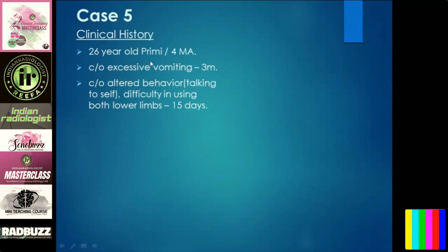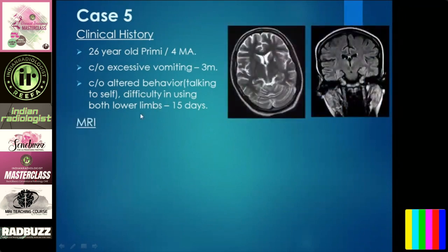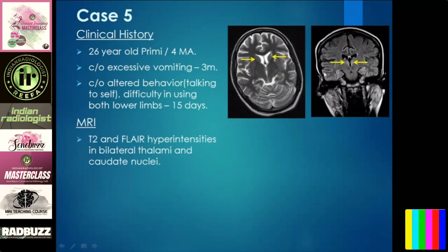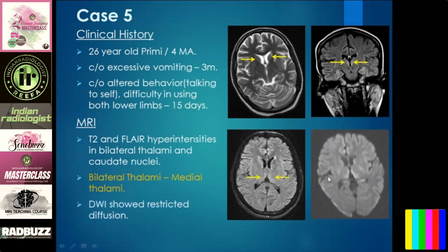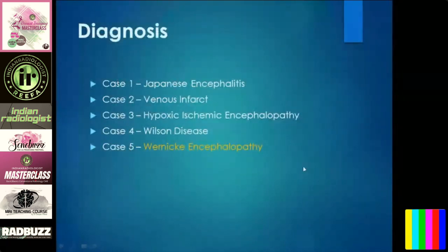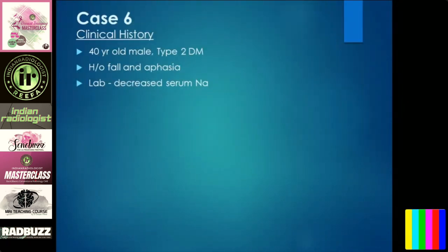Case five: a 26-year-old primigravida with excessive vomiting and altered behavior — talking to self and difficulty using both upper limbs. MR imaging showed T2, FLAIR hyperintensity of bilateral thalamus and caudate nuclei. In this condition, the thalamus is most commonly involved, specifically the medial thalamus, sparing the lateral part. Diffusion showed restricted diffusion. This was a case of Wernicke's Encephalopathy.